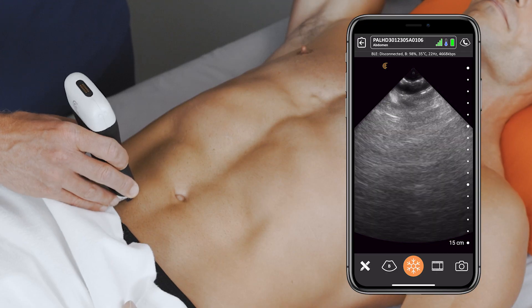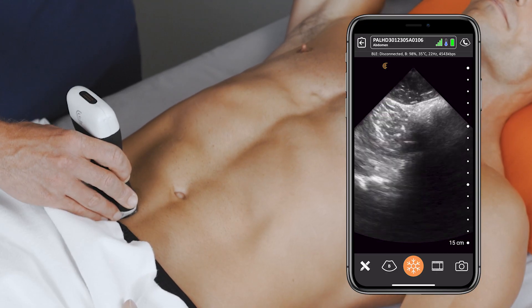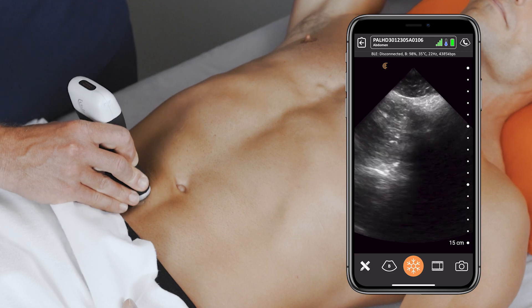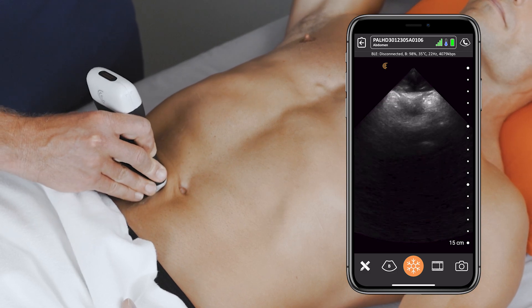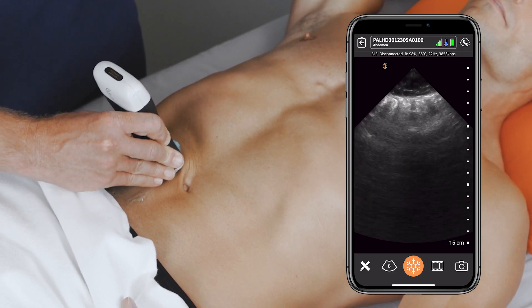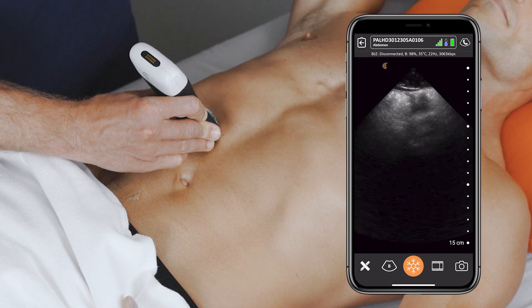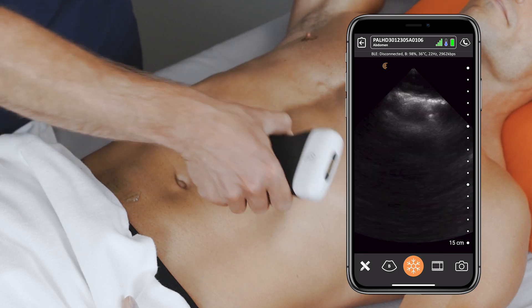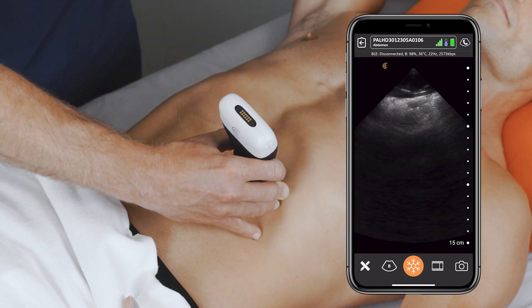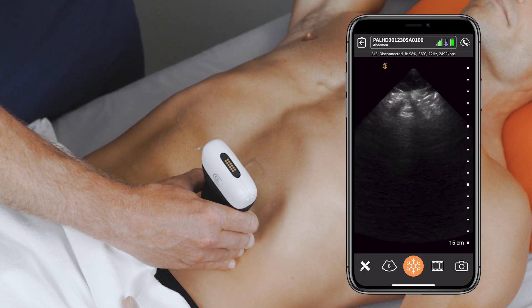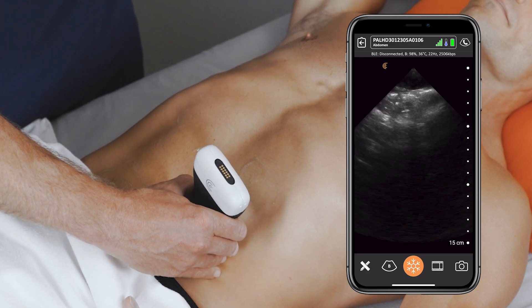My bowel obstruction protocol is quite simple. I'll start here in the right lower quadrant in the transverse, and from here I'm just going to slide the transducer up into the right upper quadrant, come across over to the left, and basically repeat the same motion in reverse.